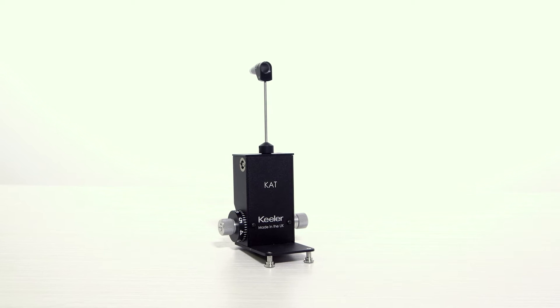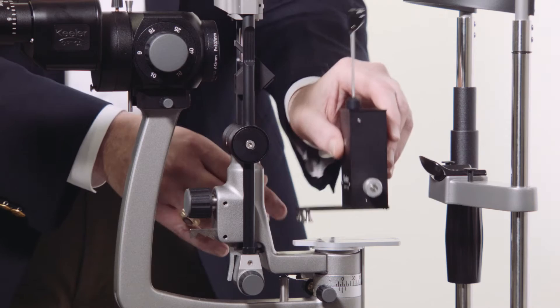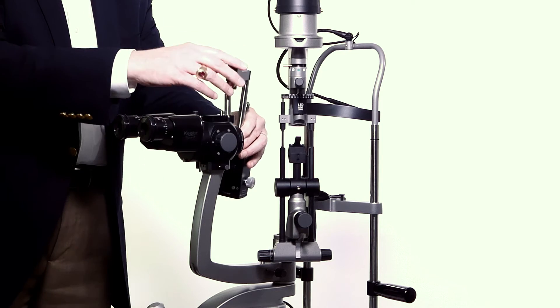The Keeler K-AT series consists of analog and digital tonometers that can be mounted on a guide plate or on a post, depending on your preference.